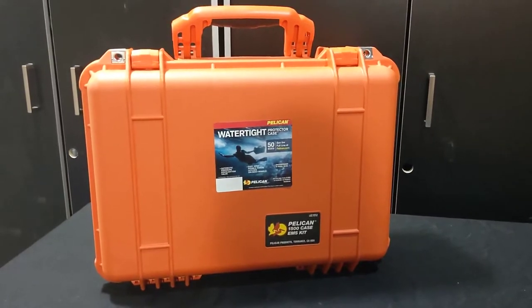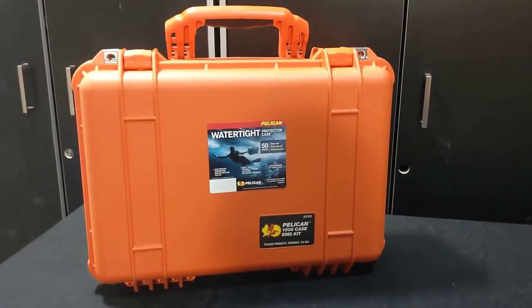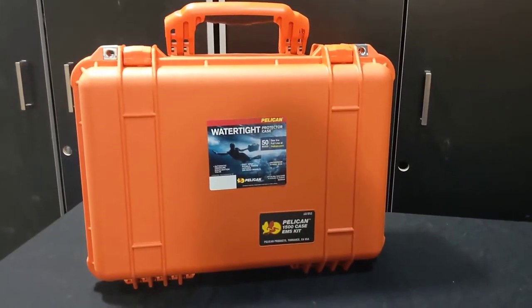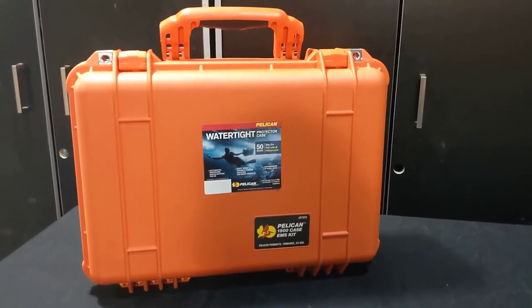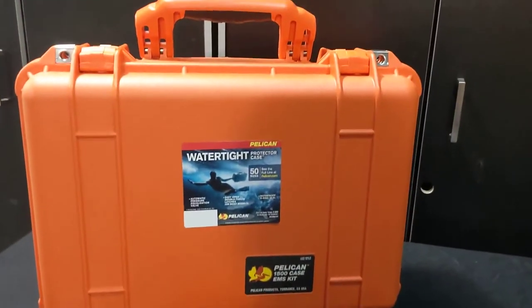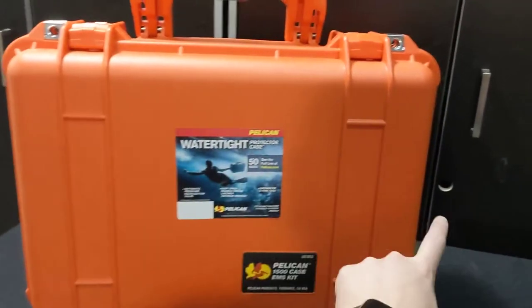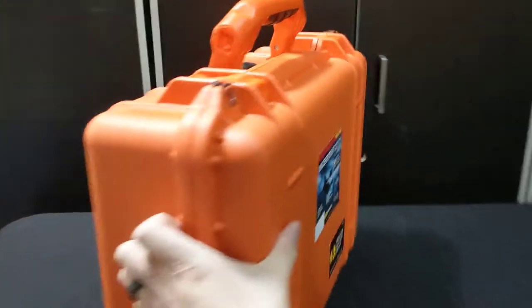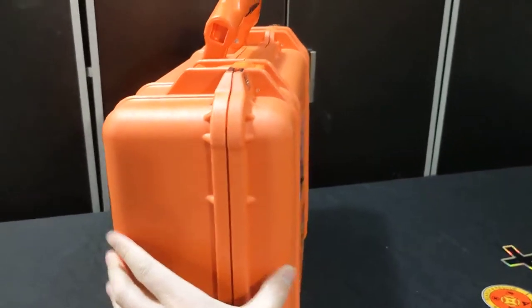This case is awesome because it's waterproof, dust proof, and drop proof. They're made in the USA and have a long standing history of EMS products. They come with all the internal organization included. The size of this kit is 18 and a half inches along here, 14 inches high, and has a depth of about six inches.